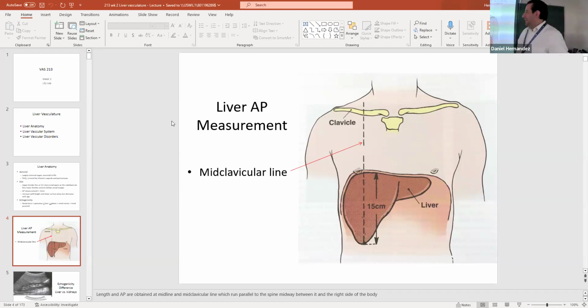Yeah, what does that mean? You're literally just going in between the ribs. Yeah, so you'll come in between the ribs, and you'll be scanning, have the kidney in the picture. Yeah. When we get in the lab, I'll work with you guys. Okay, cool. Yeah, this is brand new for them.